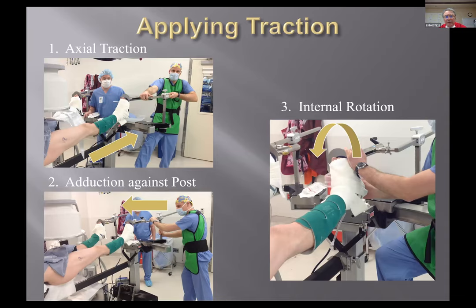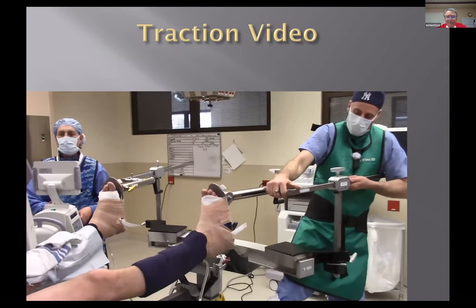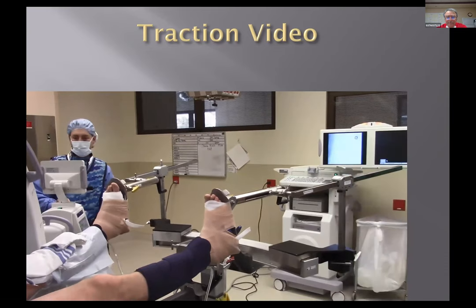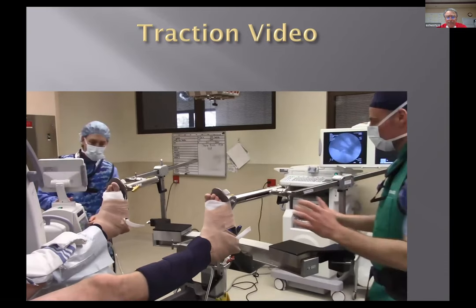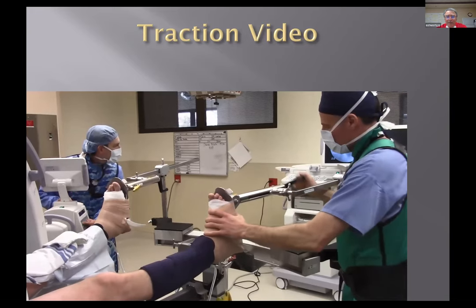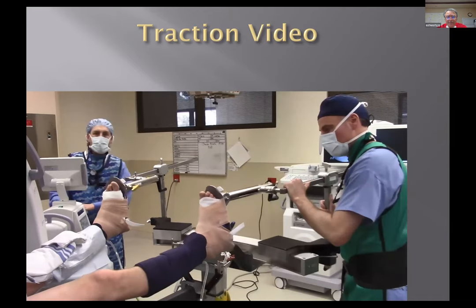So first thing we do is we pull longitudinally. This is Brian White, great guy out in Denver. I'll see if his video comes through on the next one. But the sequence is longitudinal traction, adduction, and internal rotation. And you have your C-arm there. So traction. Give it a little crank there, Brian. There you go. Brian's a Mark Philippon fellow. He does only these big labral reconstructions. He's going to adduct.